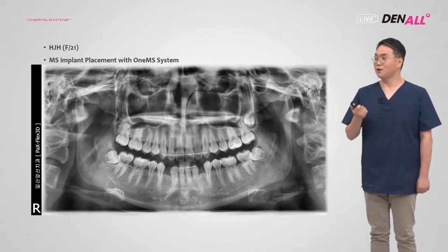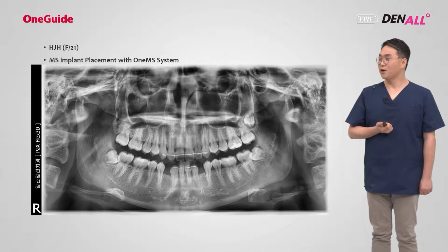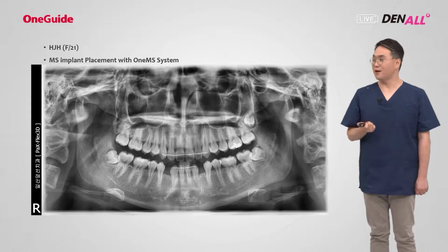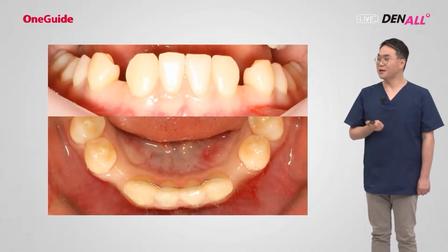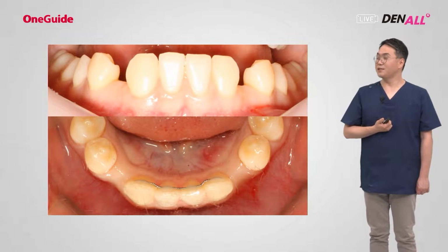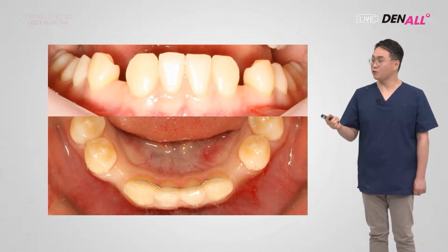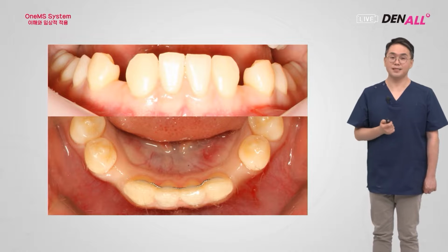21-year-old female. On the canine side, there's a missing tooth, so she did orthodontic treatment and secured some space. She came to me to have an implant. As you can see, with the MS implants, you could say I could just place that, but the mesial-distal distance might be okay, but on the buccolingual side, because there is a missing tooth, it was very thin.